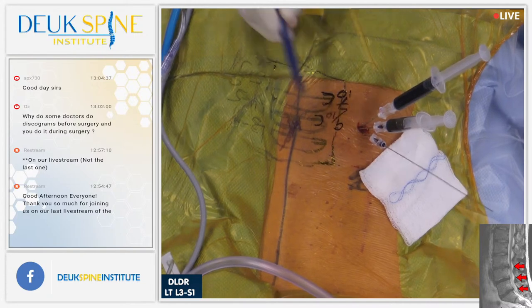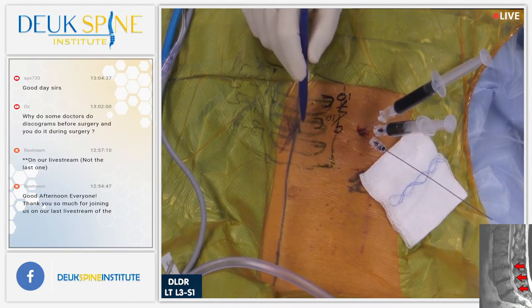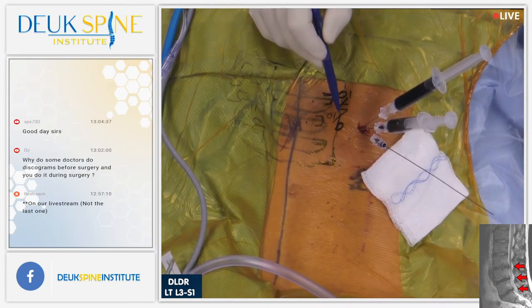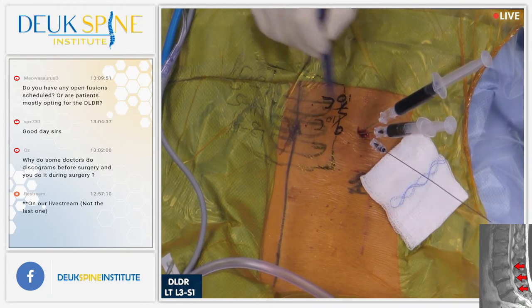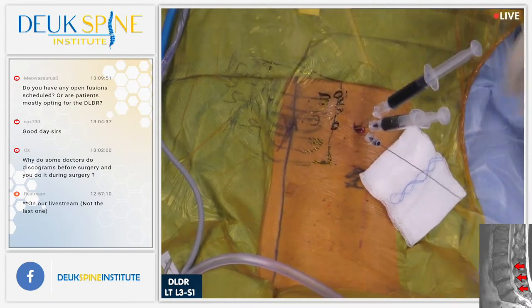So far, we know the L5-S1 is definitely causing his daily back pain that he gets every day. The L4-5 is the same. There's just a discrepancy. One is more at a 9 over 10, the other one at 7, but the only reason for that is the 7 at 5-1 is because all the dye leaked out. See, I still have dye in here because it pressurized. You need the disc to pressurize to get an accurate reading.